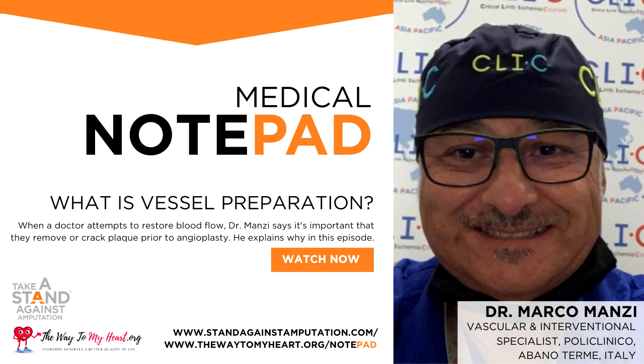This drug can pass from the balloon into the vessel's internal layer, in order to reduce the possibility of having a reactive hyperplasia from the vessel that in the future may recreate a restenotic lesion or reocclusion in that area.